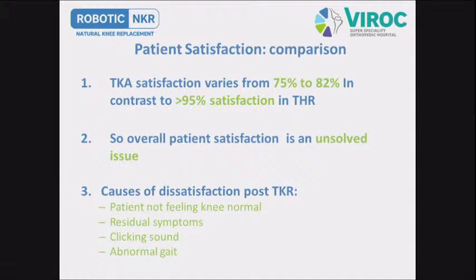And from where did the 90-degree tibial cut come? Because we don't have a precise instrument, 3 degree error on either side is possible. So we aim at 90 degree and ultimately we'll end up with 3 degree error on either side. And there was a study, even with this mechanical instrument, in 18% of knees we are outside 3 degree. So altering natural anatomy disturbs the natural concentricity of ligaments. Balancing of ligaments, we do it by releases, and it nowhere comes near normal knee biomechanics. Can this be a reason for dissatisfaction in mechanically aligned knee replacement?